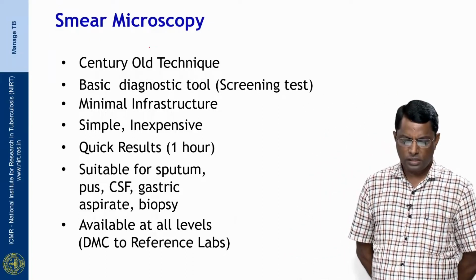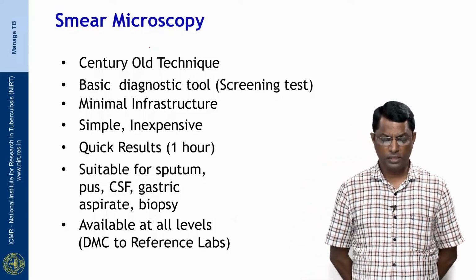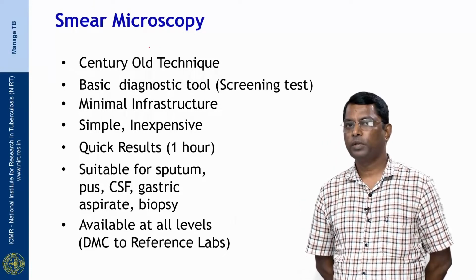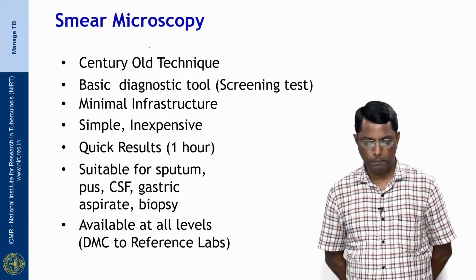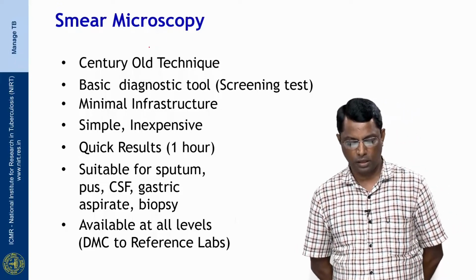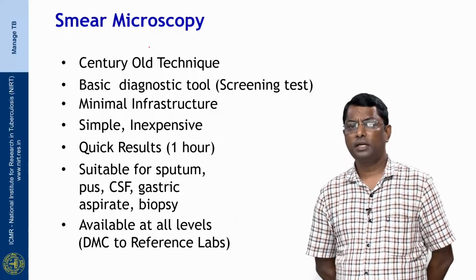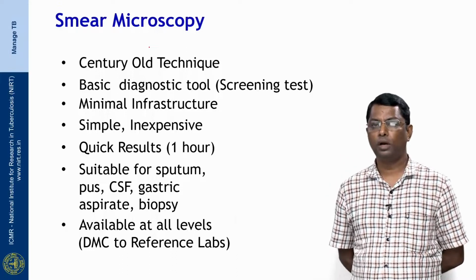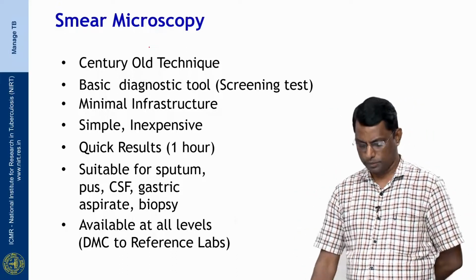The advantage is it requires minimal infrastructure, it's very simple, inexpensive, quick, and suitable for any type of specimen like sputum, pus, CSF, gastric aspirate, biopsy, and so on. And it is available at all levels of laboratory, starting from the lower district microscopy center to the reference laboratories.